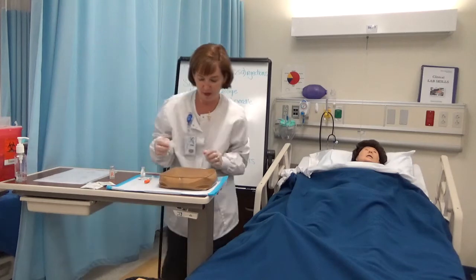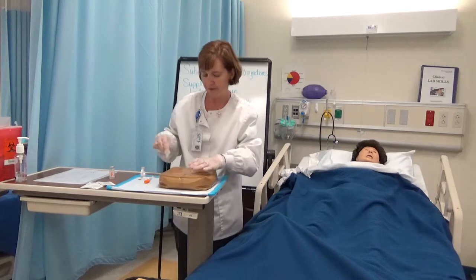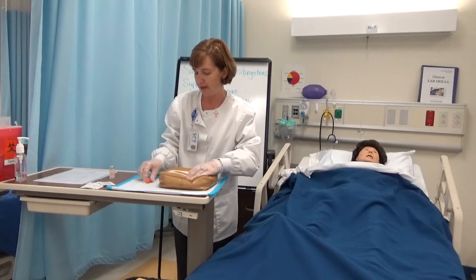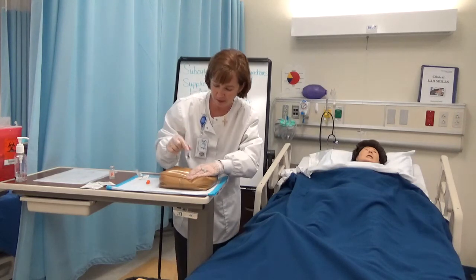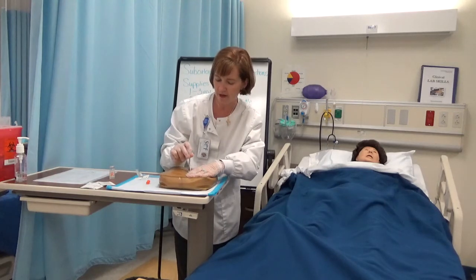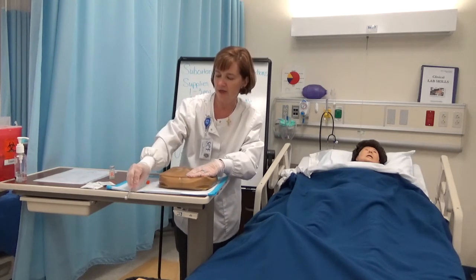Okay, Miss Cross, I'm going to clean your skin with some alcohol. It's a little cool. For sub-Q, I'm going to pinch up. I have my syringe. I'm going to hold that again like a dart. I'm going to go straight in. I'm going to push down. Slowly let go of my squeeze. I'm going to hold that syringe in for a couple seconds to let the medication absorb. Pull that straight out. Activate my safety.